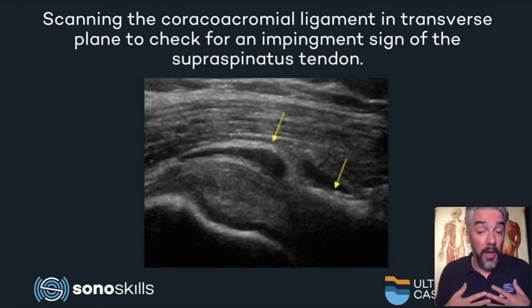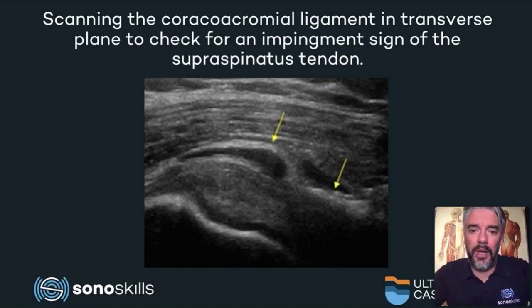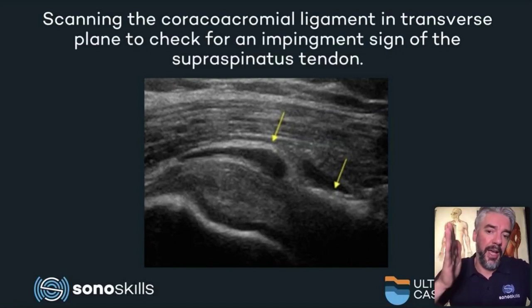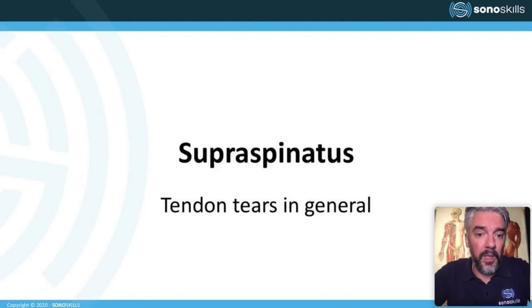In my experience, measuring the anterior supraspinatus tendon with the coracoacromial ligament gives you much more results than only measuring at acromion level. Although at acromial level, you can see this in all books, the transverse tendon in relation to the longitudinal tendon I actually rarely see in the literature.